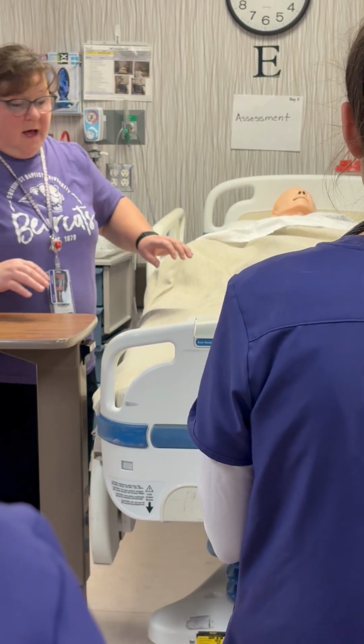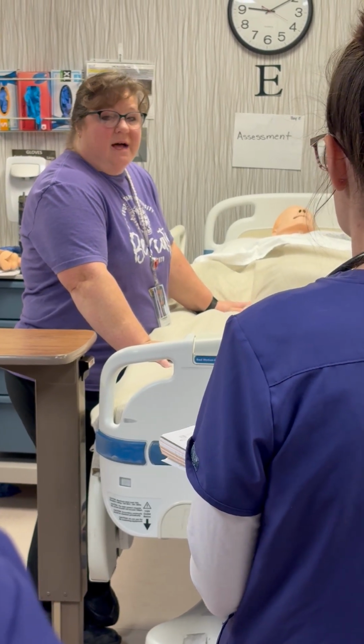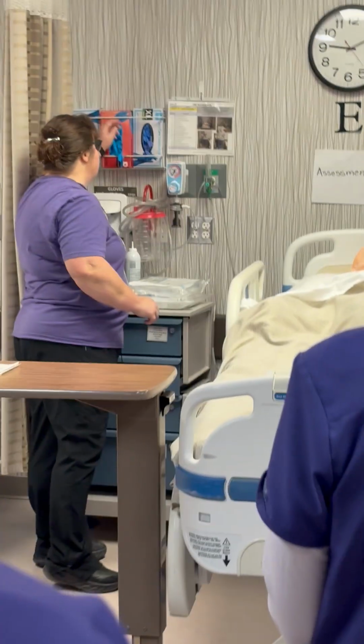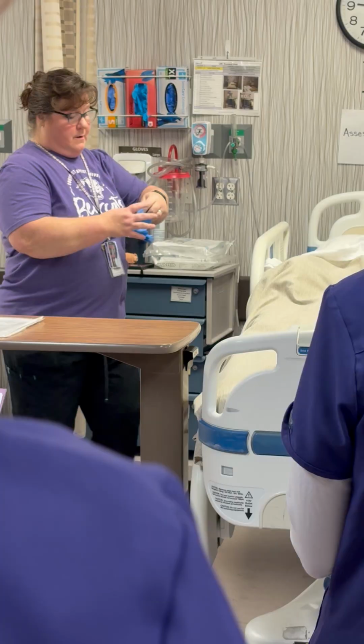All right, then the first part that you're gonna do is not sterile, so you just need wall gloves, right? You already washed your hands, so now you're gonna put on your wall gloves. All right?